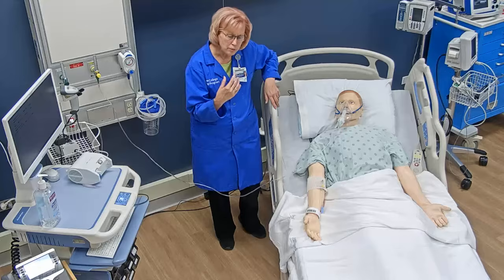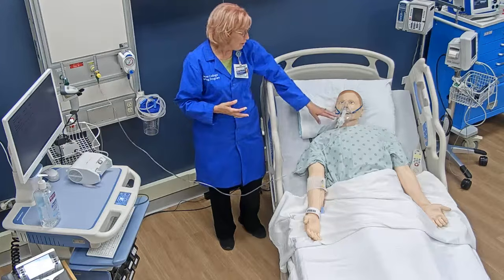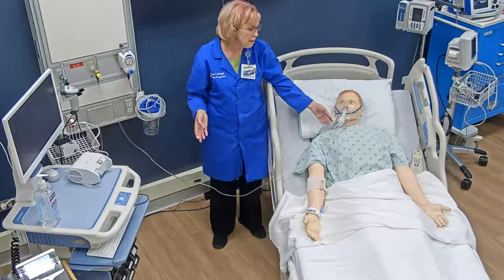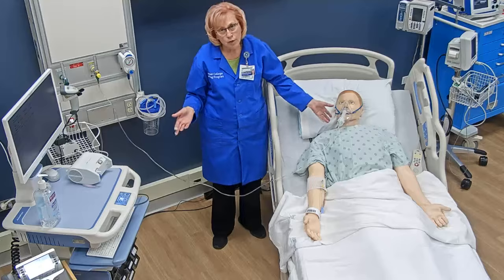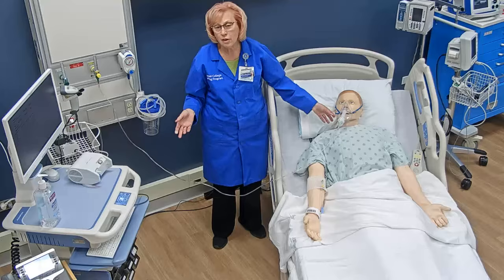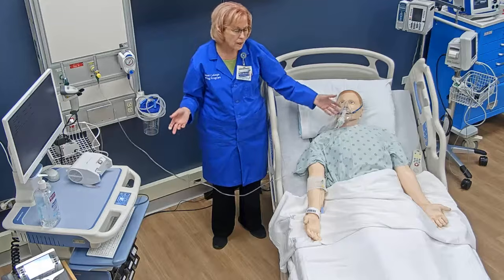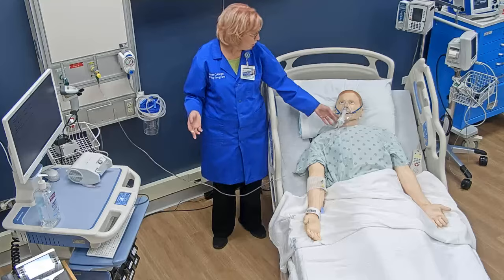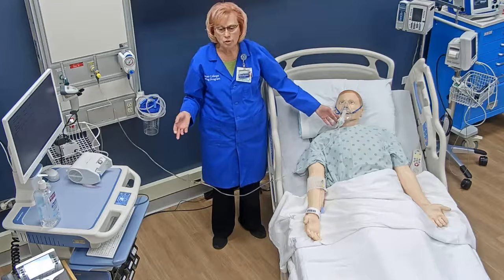How long this takes depends on the medication and the volume of the medication. So this was 3 milliliters. It'll probably take about 10 or 15 minutes. Sometimes patients get several different medicines all together. It might take 20 minutes. It depends on the medication and on how quickly it's being delivered to the patient.